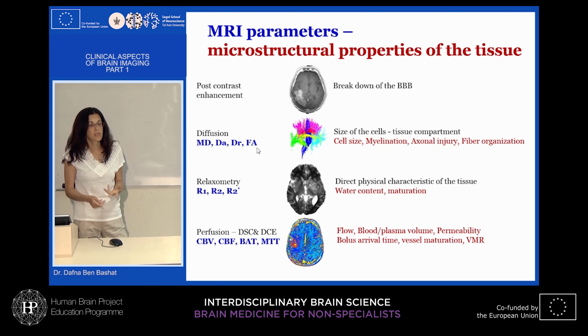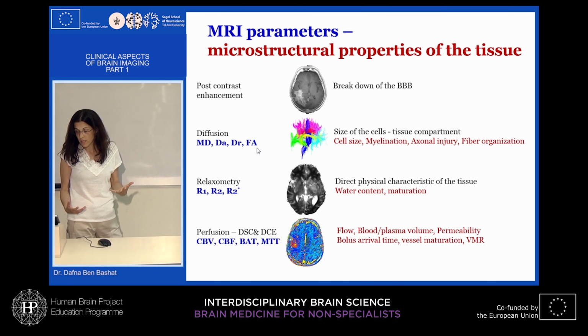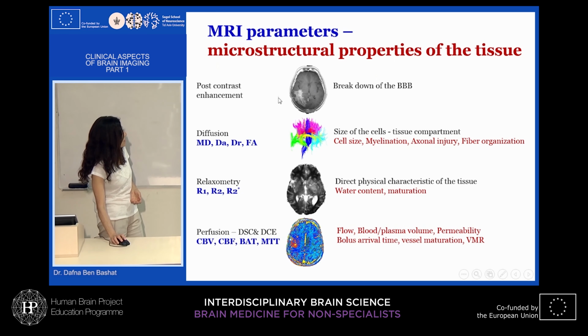It can be necrosis, tumors, inflammation, a lot of things that can be represented, but this is one parameter.